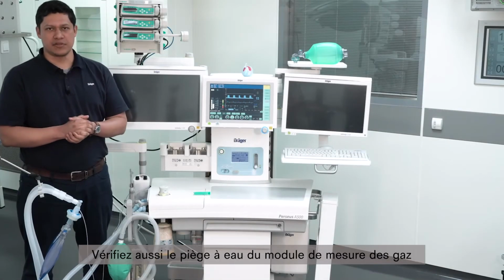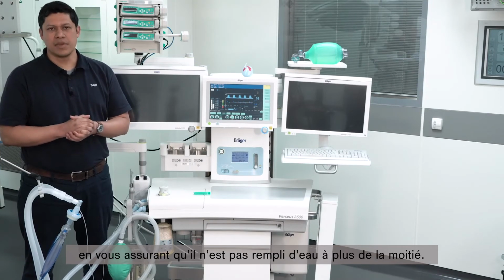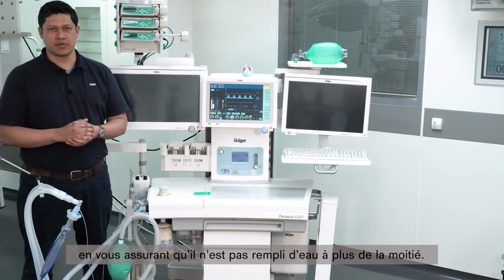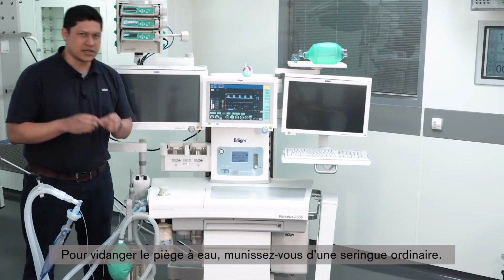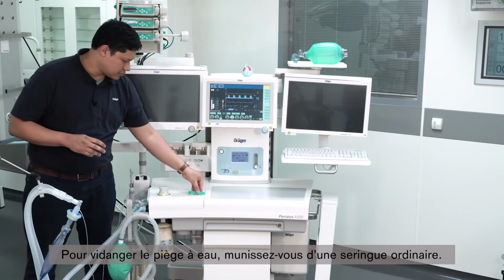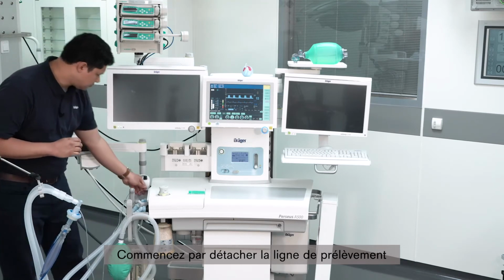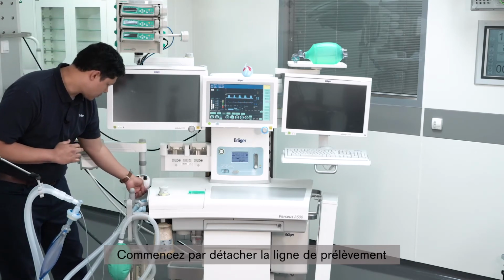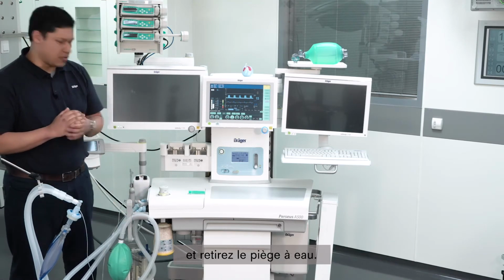Another important element to verify is the gas measurement water trap. To do so, make sure that no more than 50% of its capacity is filled with water. To drain the water trap, you will need a regular syringe. You first detach the sample line and you take the water trap out.